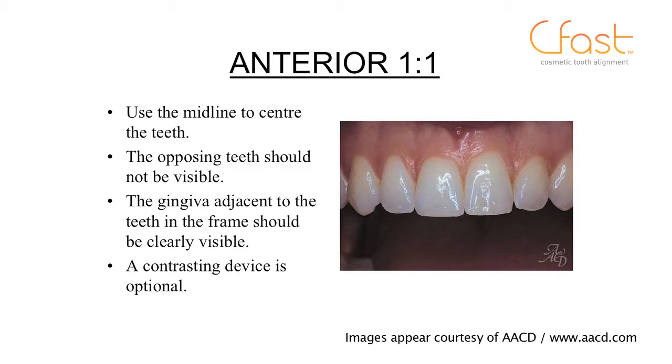And one can use a contraster. Now, a contraster is basically a black paddle. You can get dedicated photographic contrasters, or a little tip is you can buy one, they're not cheap, and then you can get some black card from your local store, hardware store, we might say, or Hobbycraft in the UK. And you can cut them out and they become a disposable item.